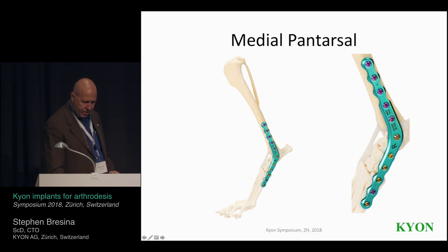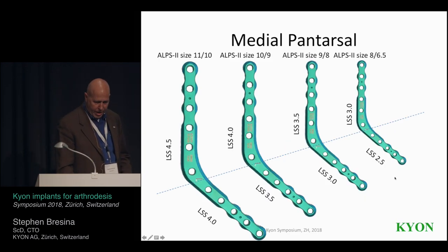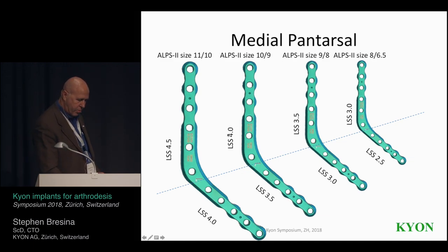There are two different sizes of screw holes in the plate, so the proximal screws are sized larger than the distal screws. So this is the size offering that we have. We have four different sizes. The one that you saw on the model is this one here. It's based on an ALPS 10 size, ALPS 2 size 10. So the size 10 has a 4.0 locking screw, and the size 9 has a 3.5 locking screw.